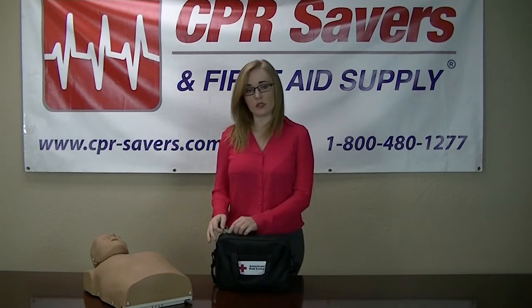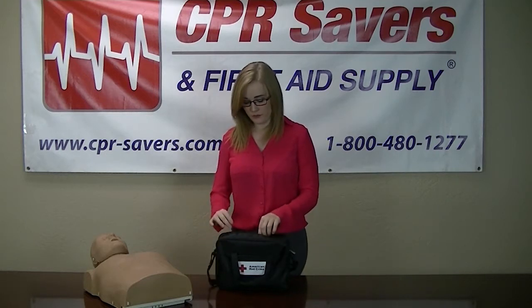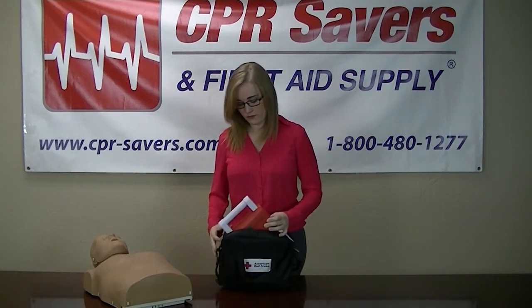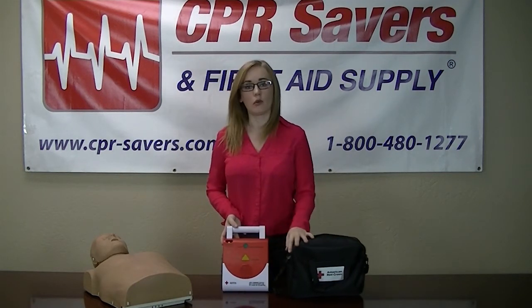Each trainer is going to come with its own black nylon bag with a removable handle. The unit itself is quite small. It is our most economical unit to use.